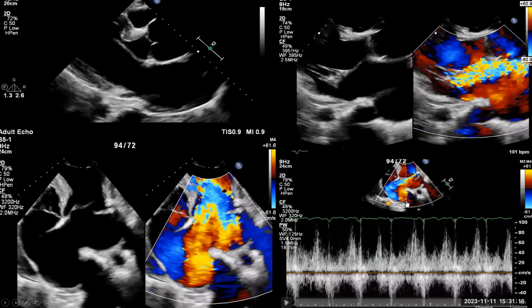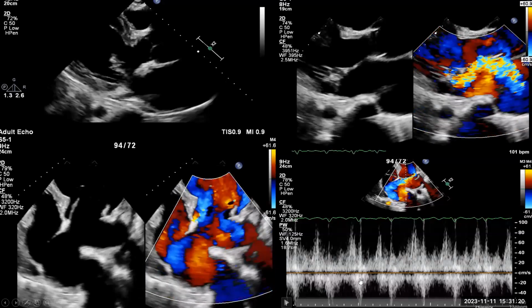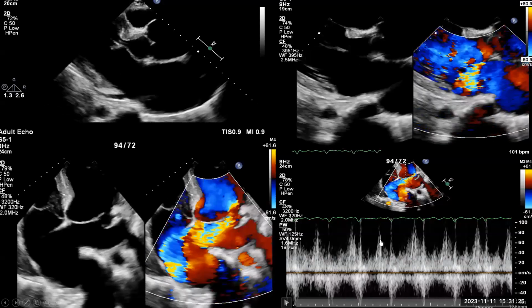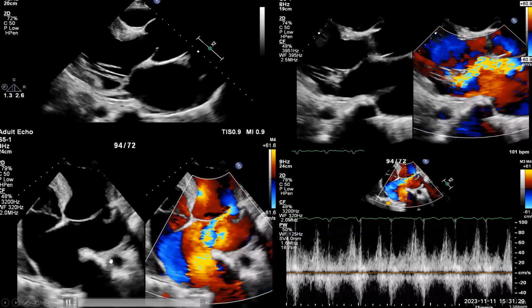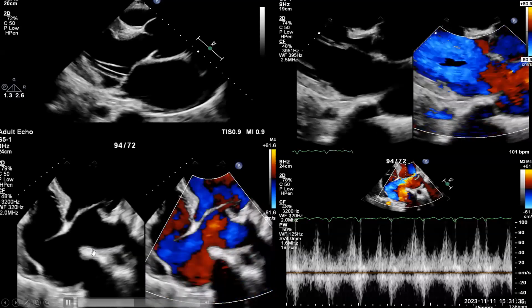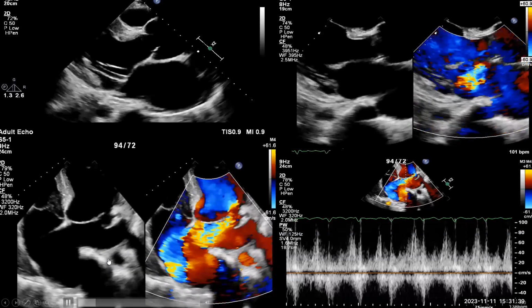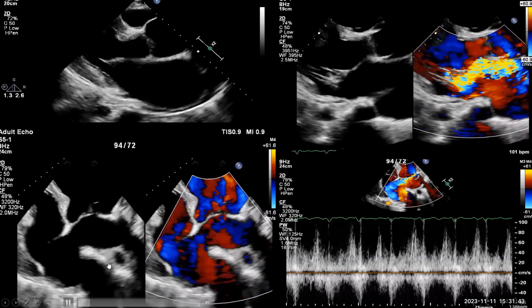Here on the right, this is pulse wave across the pulmonary vein, and it showed very clear systolic reversal, and this is suggestive of severe MR. However, don't care about this line shadow. This is because the patient has chest deformity and spine deformity, severe kyphoscoliosis. So sometimes you'll see this shadow, which is just part of the spine, pushing the left atrium.